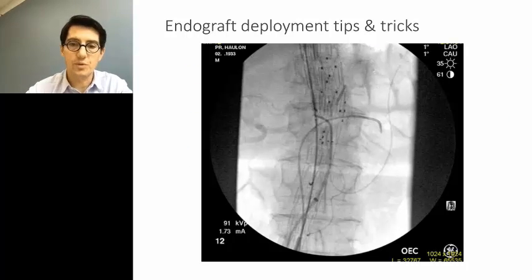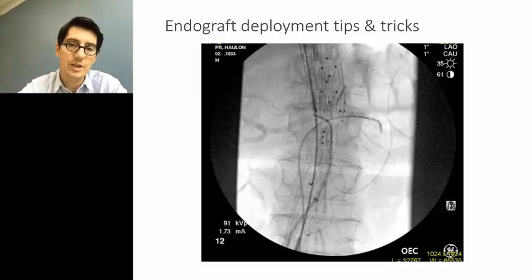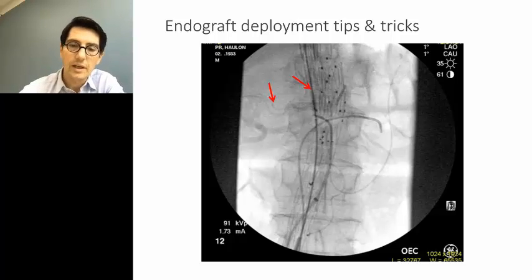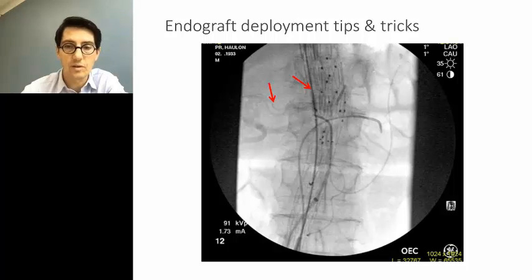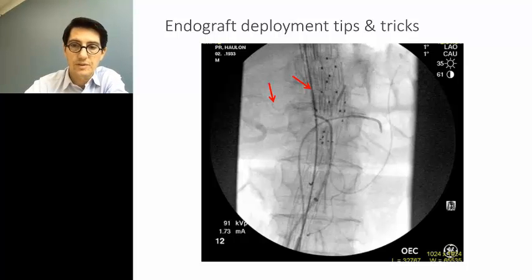Here are some tips and tricks. Before having access to the hybrid room and fusion, you can see I have the tip of my catheter through the right renal fenestration injecting a little bit of contrast — the arrow is slightly offset but I know that pushing my wire would get it into the right renal artery. On the left side I had pre-positioned a catheter inside the left renal artery as a fixed marker — a poor man's fusion — positioning wires and catheters in the target vessel. You can see how helpful it is to have fusion because I don't need to do all those steps anymore.